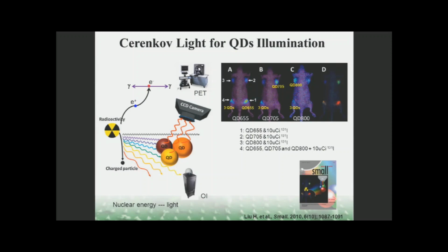As Dr. Kramer also talked about, when we think about Cerenkov photons, what are their other applications? Definitely they are a light source, so they can be used as a new way to excite fluorophores. Conventionally we always use the gamma rays, where the positron produces two photons that can be used for PET imaging. With Cherenkov photons, because they have continuous, broad wavelengths, they can excite multiple fluorophores simultaneously.